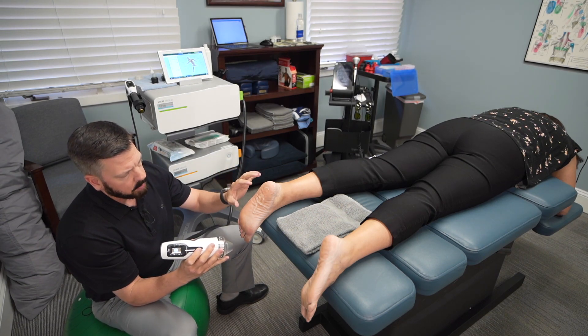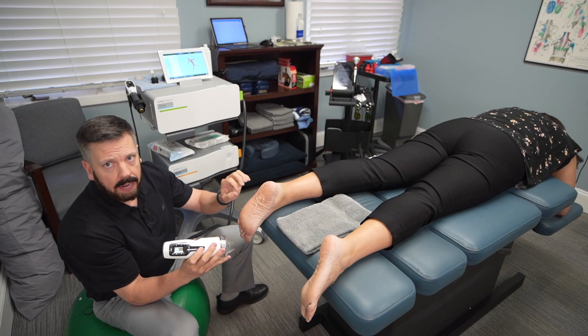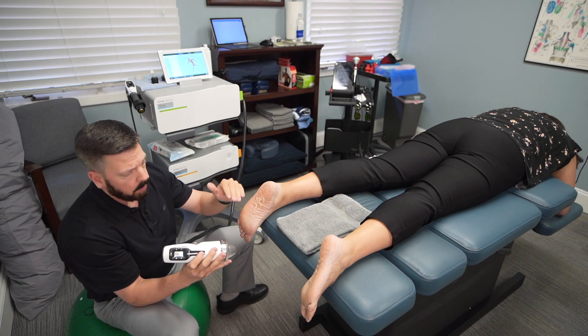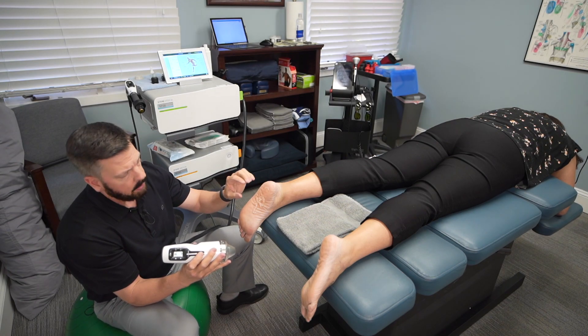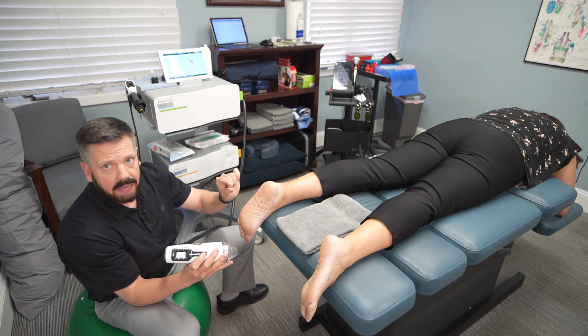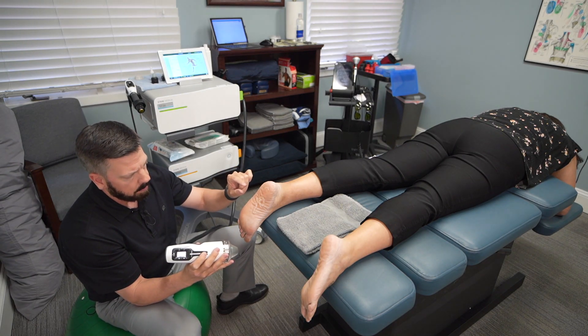When we get over the problem spot, it'll feel like a deep dull ache, almost like it's going down to where that plantar fascia attaches. That helps me figure out exactly where the problem is. You may feel a little achiness in some spots and then feel a lot in another — that's the exact point in the plantar fascia that needs to be treated.